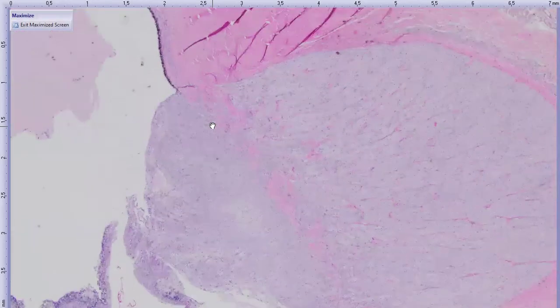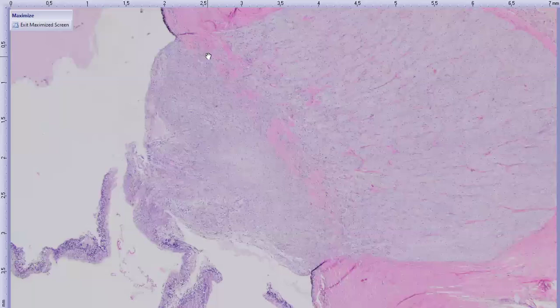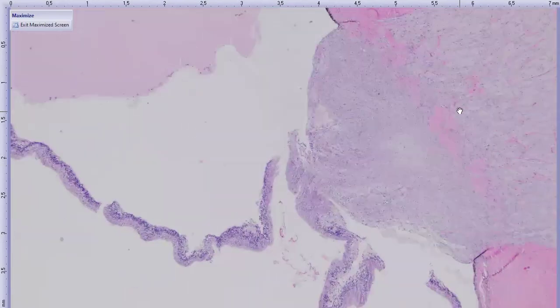There we go. So this optic nerve is interesting. The beams of collagen of the lamina cribrosa are not quite level with the choroid, to my mind. So maybe there's some subjective cupping. There's a lot of extra tissue on top of the lamina cribrosa. Horses sometimes get this proliferative glial thing in the optic nerve head. I didn't necessarily call it in this case because there are some other changes that could be distorting the tissue in this area, but maybe some degree of optic nerve head atrophy.